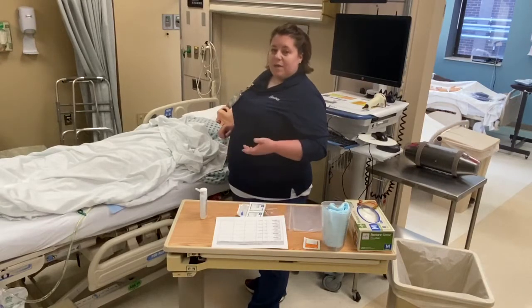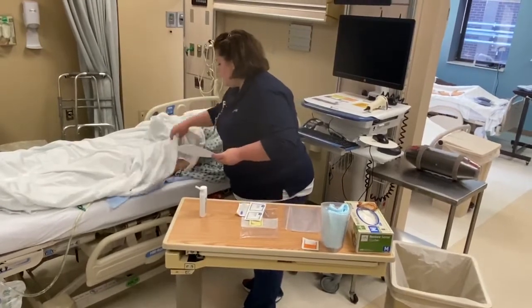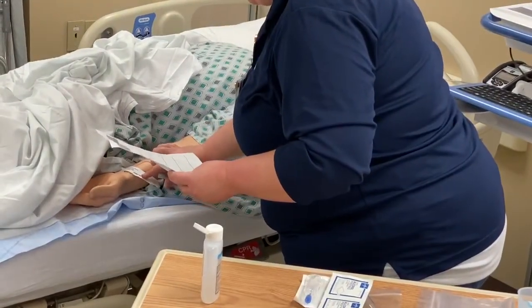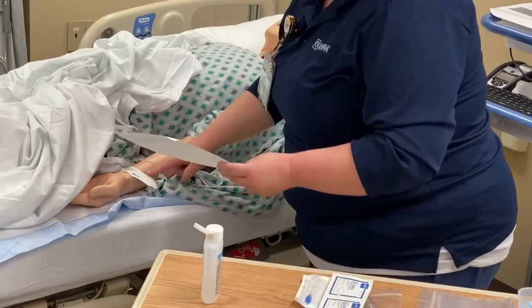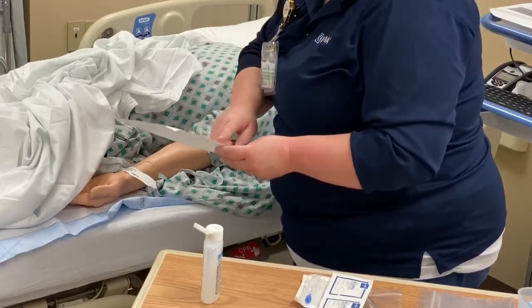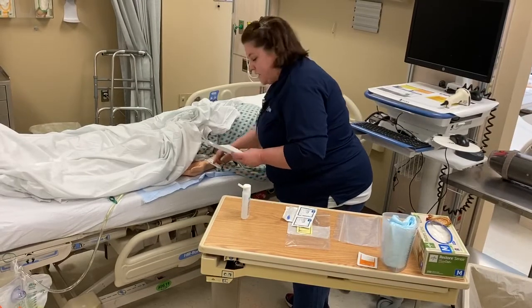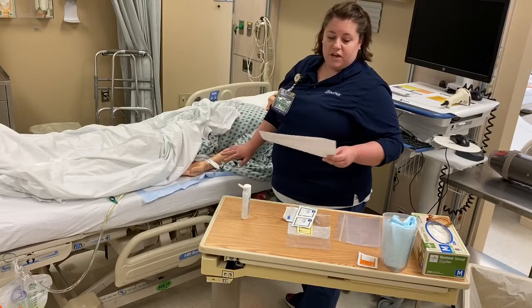and I'm going to ask my patient to state her full name and her date of birth. So I'm going to compare this to the wristband. So she said her name is Miriam Muhammad. I see that. And her birthday is December 7th, 1954. I compare that. And then I'm going to compare her MRN. I like to read it out loud because it makes it easier for me to catch if there's a mistake. 098, 766, 55. So I've asked, insured, and verified my patient information.